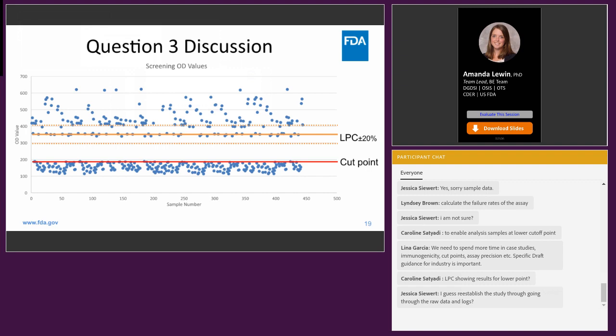So it's definitely something that you want to be sure your LPC is set correctly. And then if you move into sample analysis and maybe something changes, be sure to monitor it in relation to your study samples. Okay, so that's it with that case set. Let's move back into the recorded session with our final case set for the day.